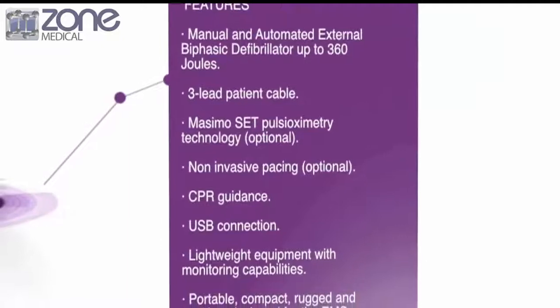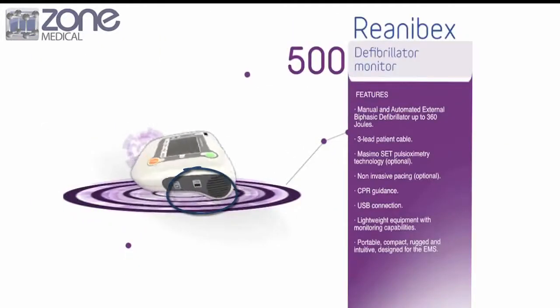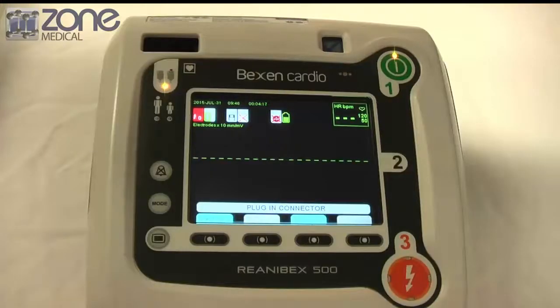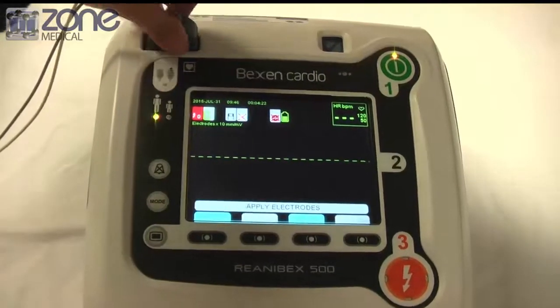This device includes technical data that you can transfer via the USB connections — there are two on this device. To perform a test, you will need to press the power button at the top of the device. It's very easy to use as it's only a two-step function.